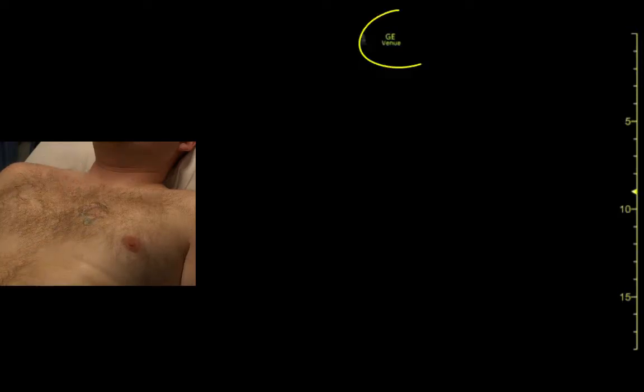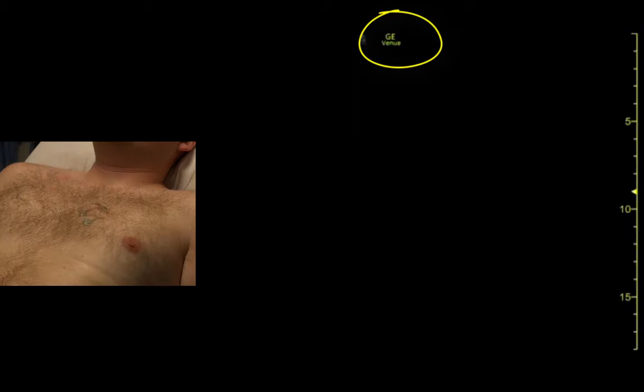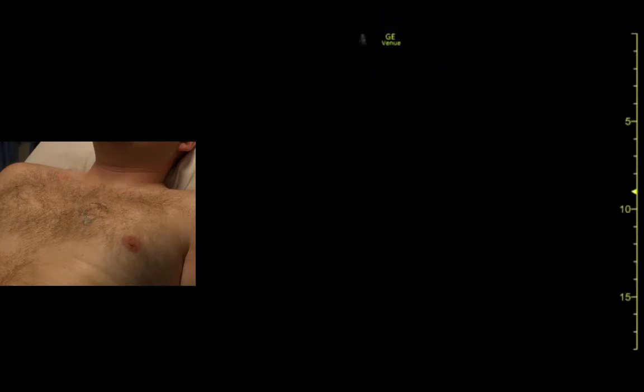We're in cardiac mode. Our indicator is flipped on the other side because we're in a cardiac setting, and we're going to start with parasternal long axis.